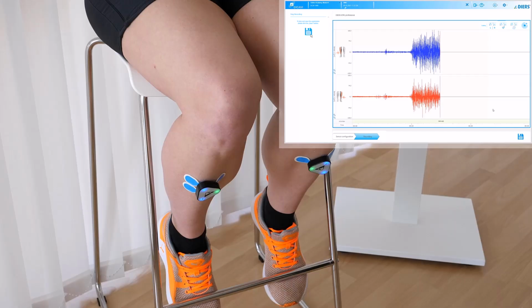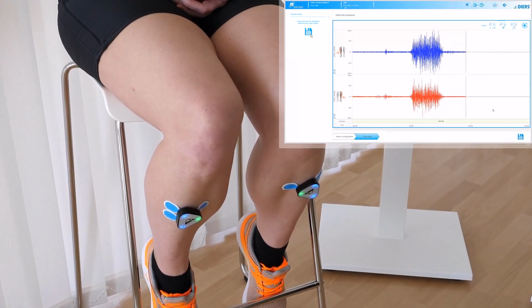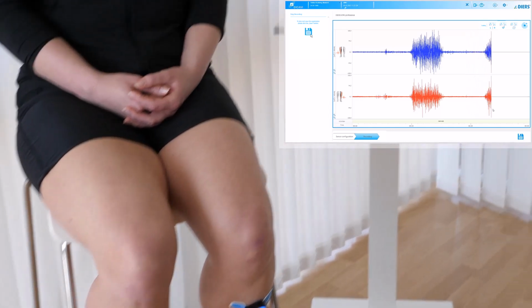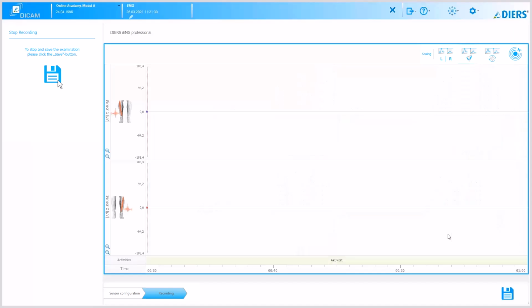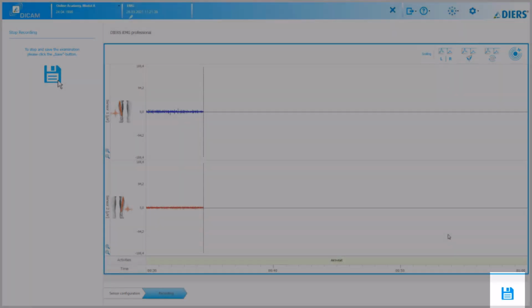We repeat this 3 times with a short pause. Again into contraction and then relax again. Again a short pause and another contraction. Hold it for a short time and relax again. Hit save to stop recording. After that, you will automatically be forwarded to the recorded samples processing.